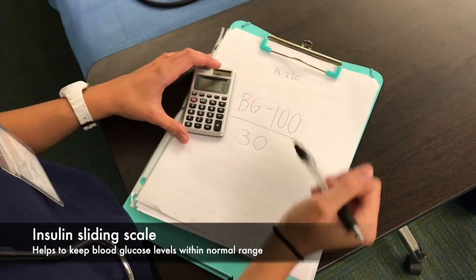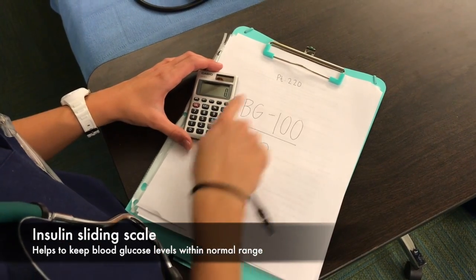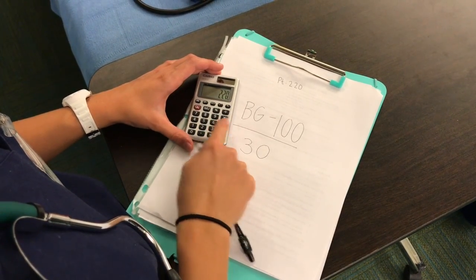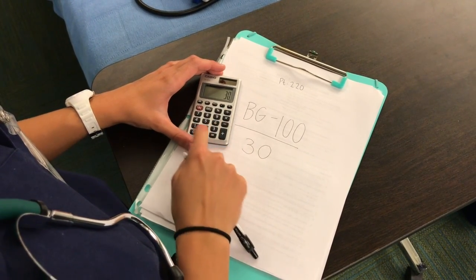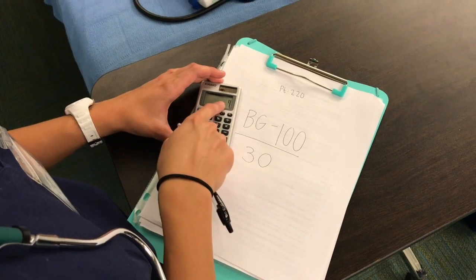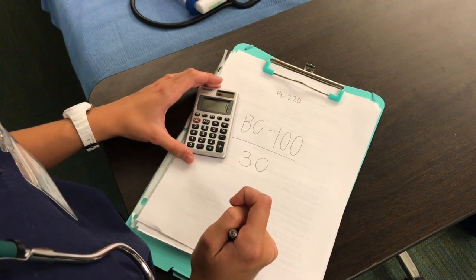The term sliding scale refers to the progressive increase in pre-meal or nighttime insulin dose based on predefined glucose ranges. Today our patient's glucose is read at 220. We will use this formula to calculate the number of units in order to administer. Our patient will be administered 4 units.